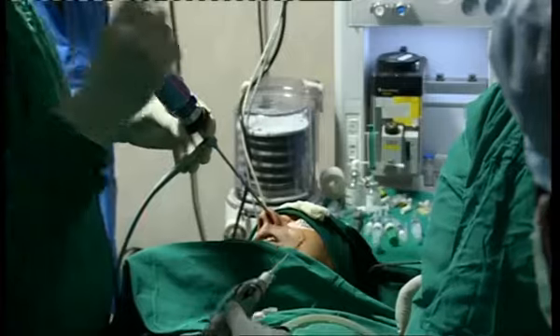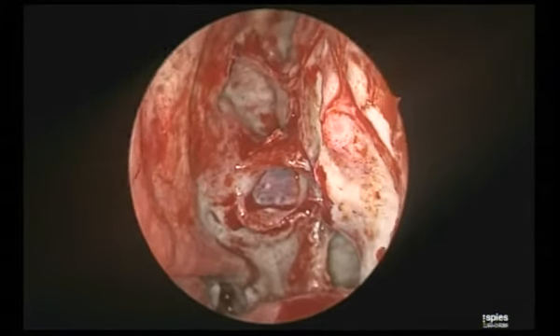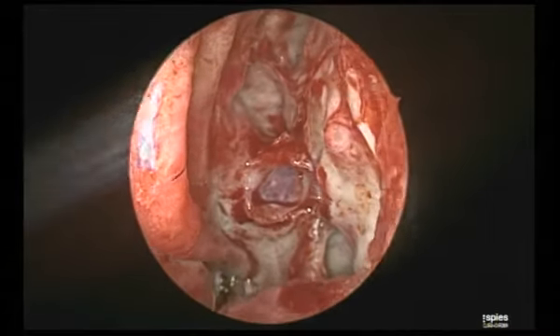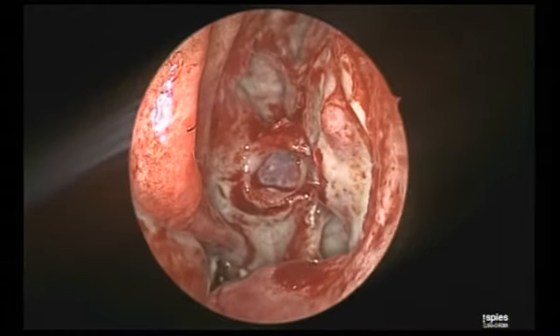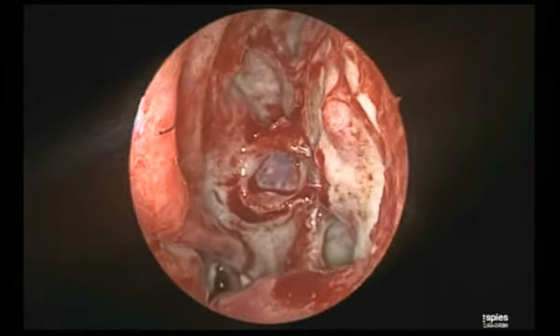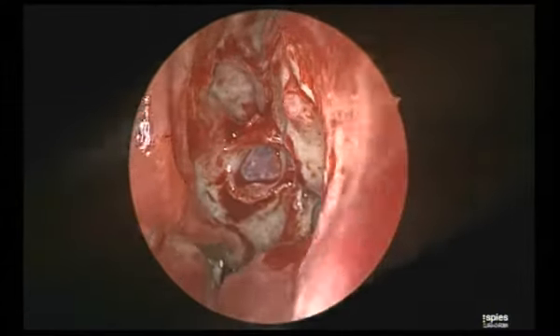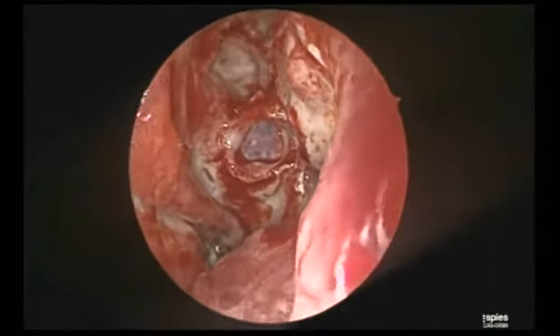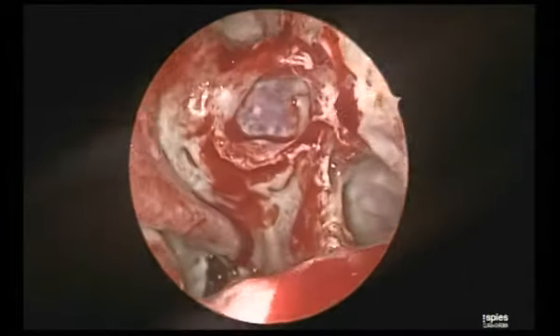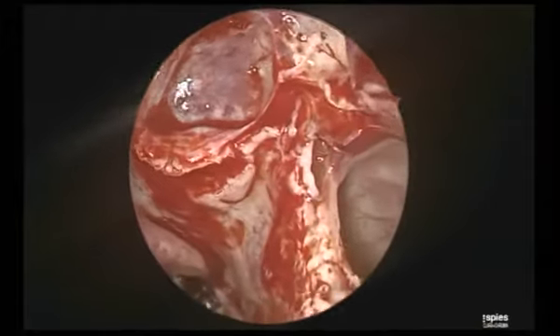The only single reason is that the surgeon doing the posterior ethmoidectomy is sometimes not aware of the posterior limit of the posterior ethmoidectomy and accidentally enters the sphenoid sinus behind. If you don't realize it and keep working, assuming it is posterior ethmoid, you can hit the optic nerve and carotid. So the technique I am going to show for the junior colleagues, if you follow this, you will never cause damage. What you all need to know, number one, is why I cleared the infraorbital cells at this point of time: to know one landmark.